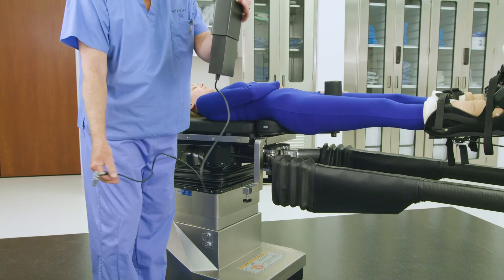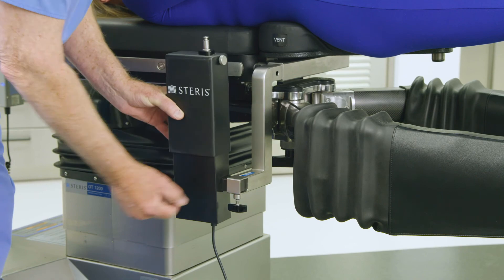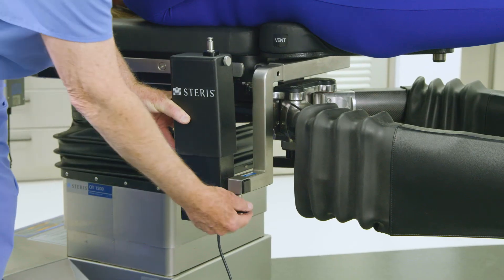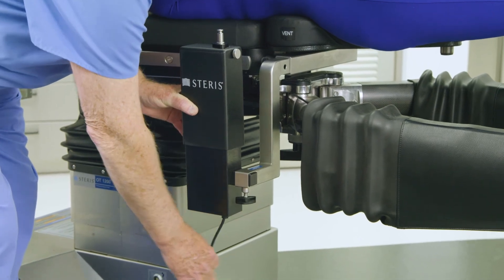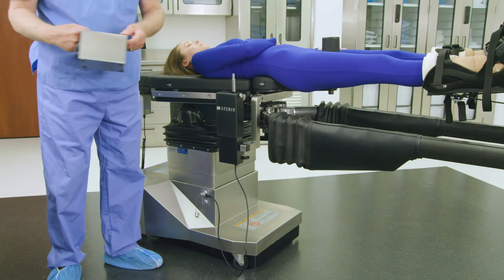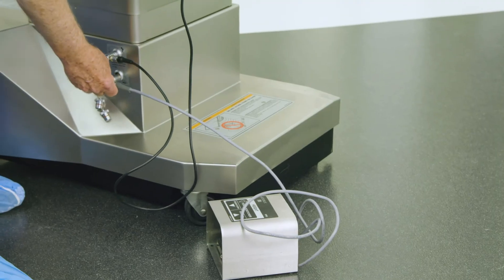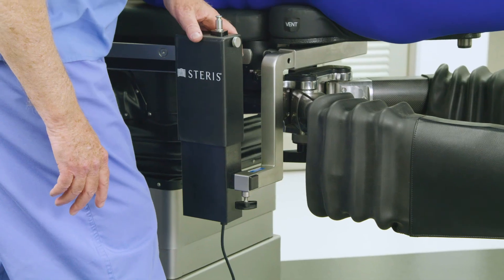Select the femur positioner drive and attach it to the S-bracket by aligning the attachment block with the S-bracket's hole. Insert the femur positioner drive so that it is positioned closest to the patient's head on the operative side. Insert the mating components and secure by tightening the T-handle on the S-bracket. Plug the femur positioner drive's cord into the orthopedic table on the side of the column. Next, attach the femur drive foot pedal's cord into the orthopedic table on the side of the column. Activate the foot pedal switch to lower the femur positioner drive to its lowest position.